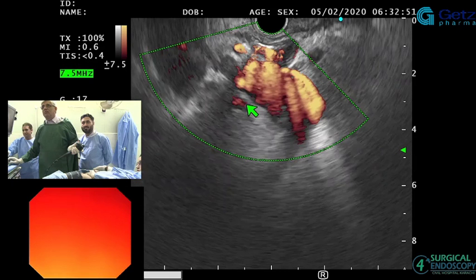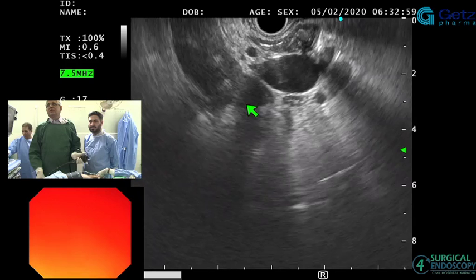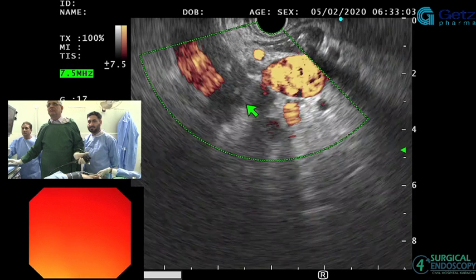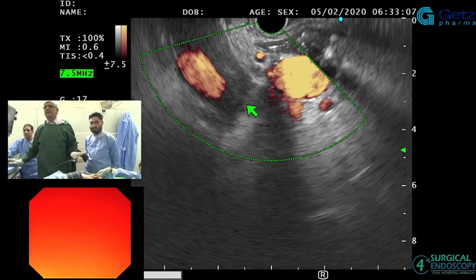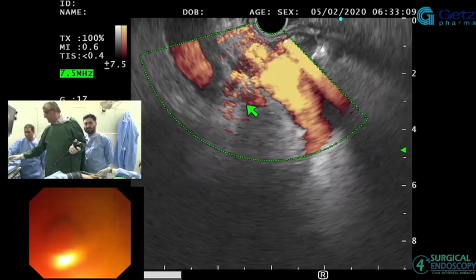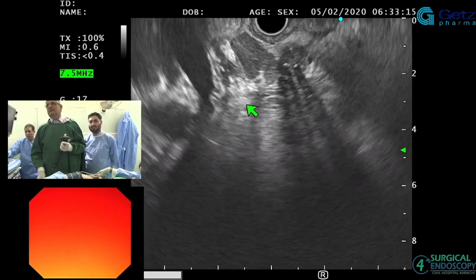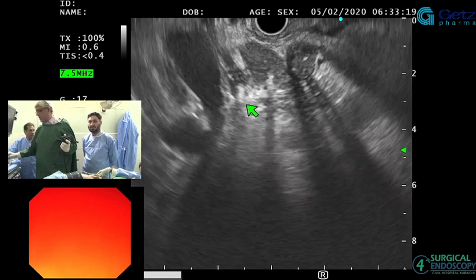They look, this is the liver hilum almost here. So we see some more here. Can you see that, Shanil? So there are multiple lymph nodes. That's what I had seen before. Dr. Saad, and there is one here. Can you just show us the liver hilum again? And I will just show you in a minute. Thank you. So we've got one large lymph node here.